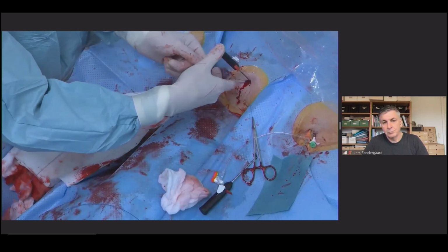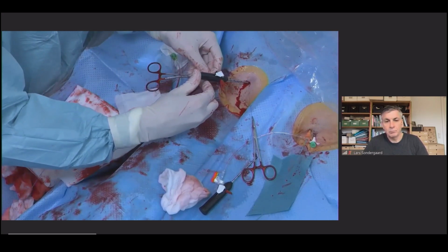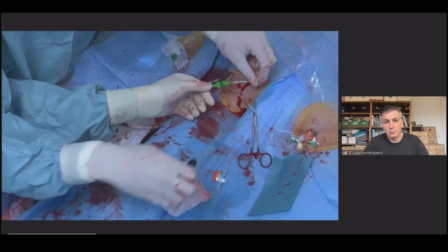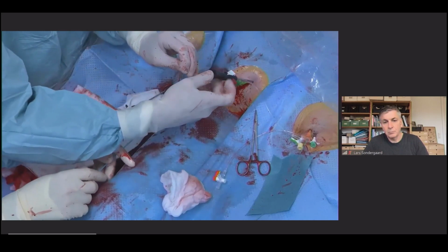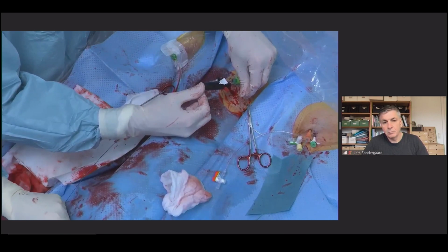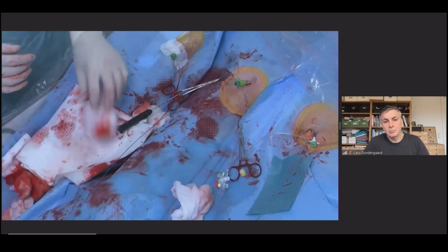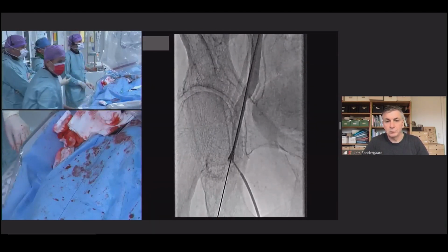So one way to check whether you have hemostasis is to go crossover from the contralateral side with a catheter and do an injection. So in this case, we have a stiff wire, an Amplatzer super stiff. And we leave that, it's still in there, and all we do is put a 6 French sheath in, take the dilator out, and we can use that for contrast injection to see whether we are okay. Looks good here externally. Perfect. Looks nice.